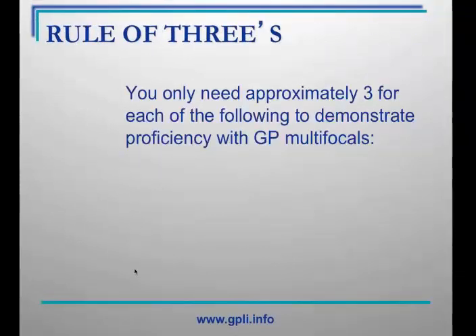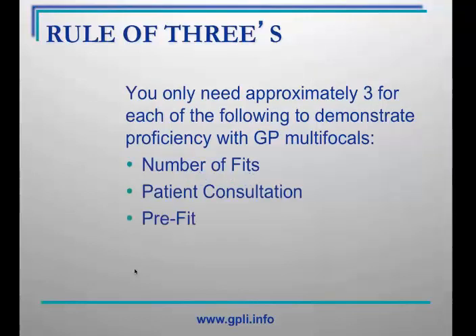Well, I think it's simply a matter of threes. Multifocal fitting, just like fitting a bitoric, is not complicated. You really only need approximately 3 in each of these categories. When the GP Lens Advisory Board, which is a group of 70 prominent GP fitters in the country, were surveyed about how many fits did it take for them to feel comfortable fitting a given GP multifocal, the most common answer was 3 patients. And the same can be attributed to these other categories, as I'll show.